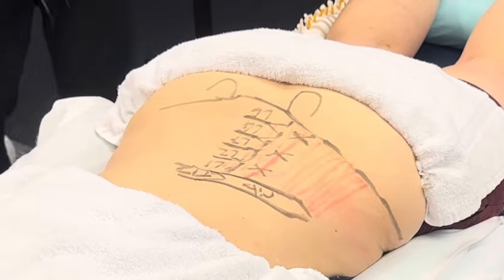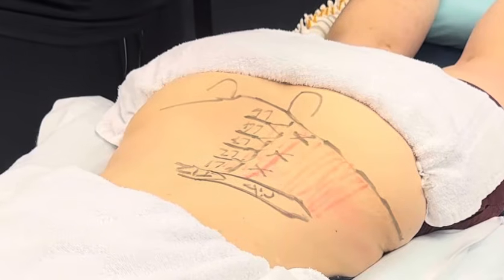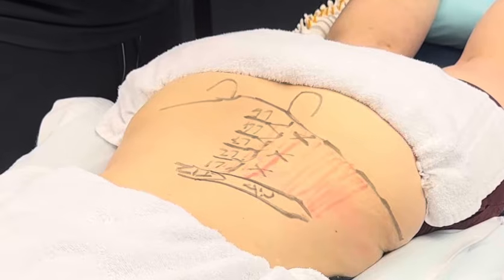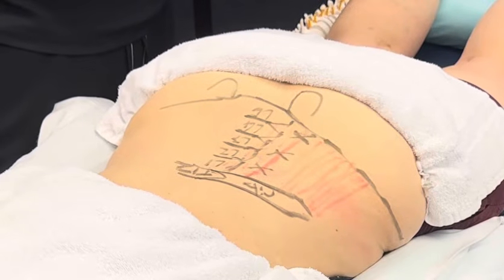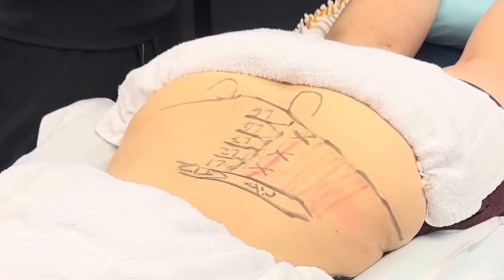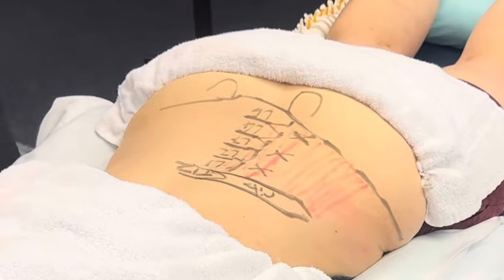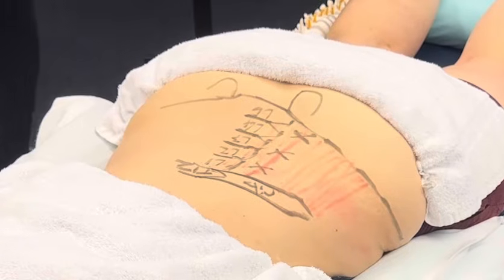You should do fine with this size of needle. In any of the boxes, is there longer ones like this? There should be some longer ones. I think they're in that box. So if you guys want to get a long one, we'll share from that box over there.